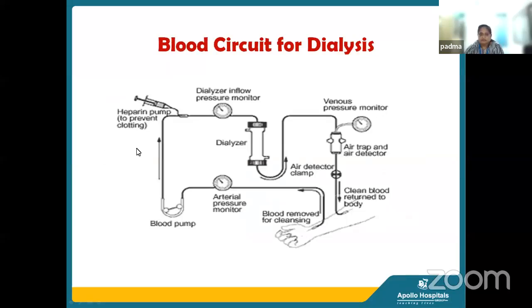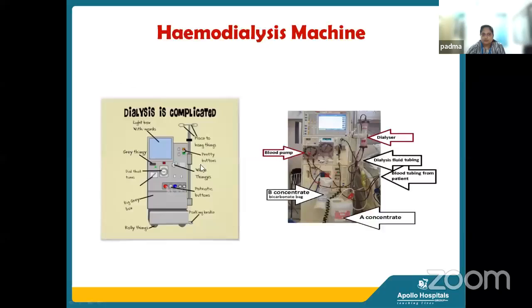This part is called the extracorporeal system, and the tubing system is nothing but these dialysis tubings.